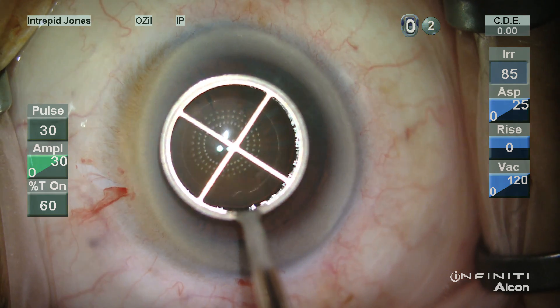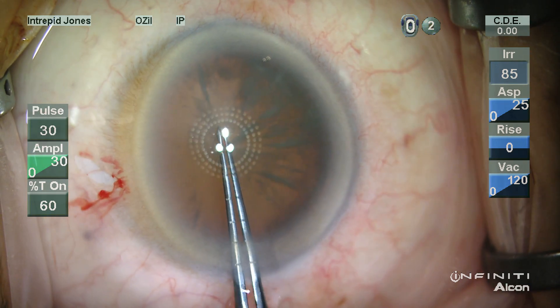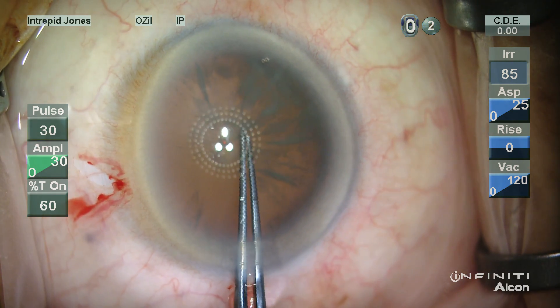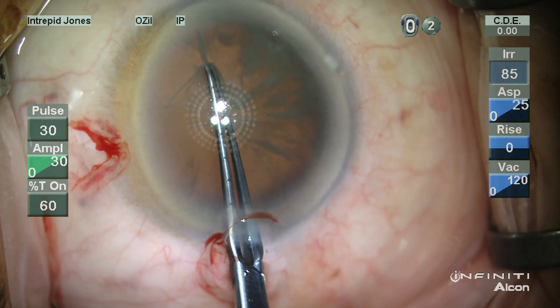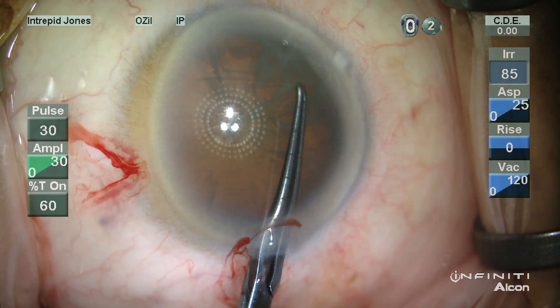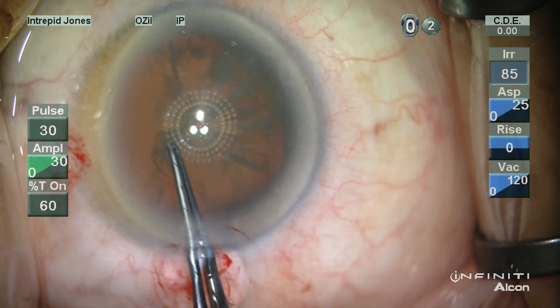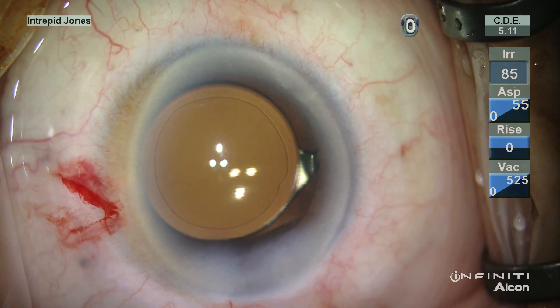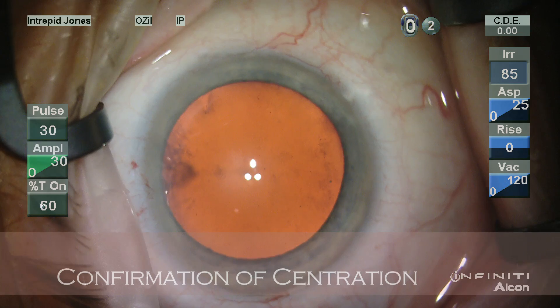Here's a situation which is encountered rather commonly. This patient has an asymmetric limbal architecture. By asking the patient to fixate on the blinking central fixation beacon and inscribing a corneal marker diameter of 5.75 millimeters, I'm able to obtain a very well-centered capsulotomy and a well-centered intraocular lens.